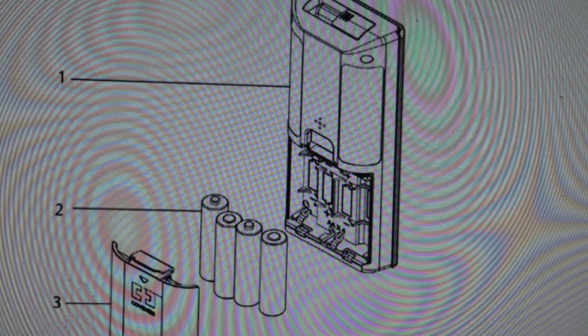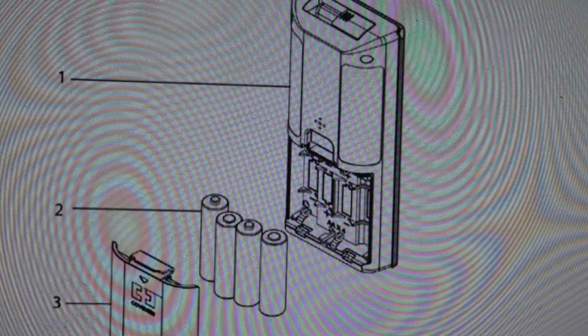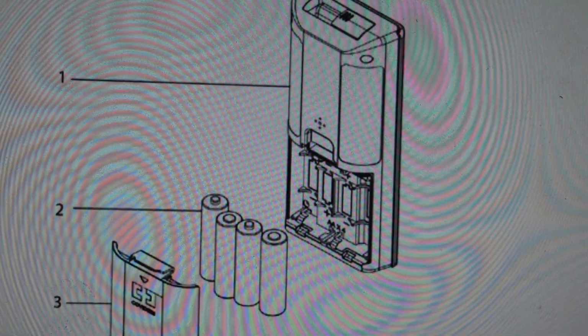Now, it takes 4 AA batteries and you need to use lithium batteries because that's what it has come with. If you want to use alkaline batteries, you can, but you will need to go into the service menu and change the battery type to alkaline.